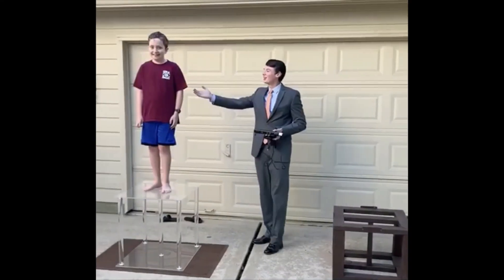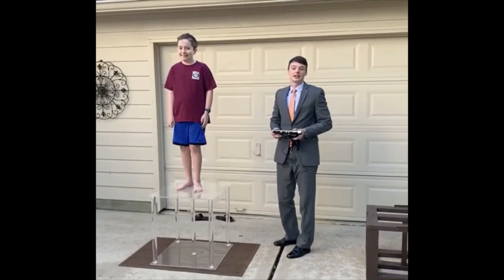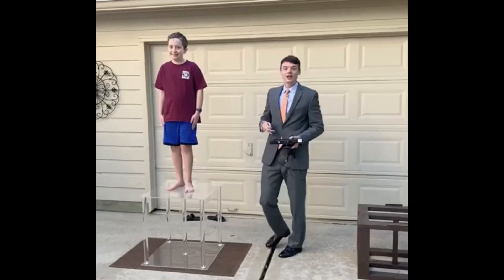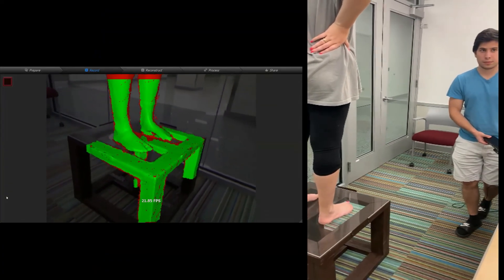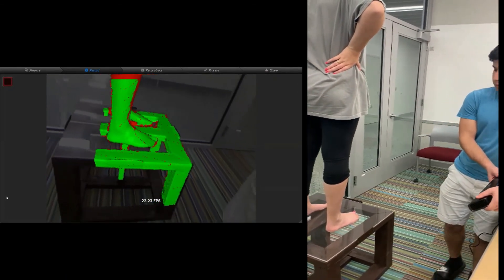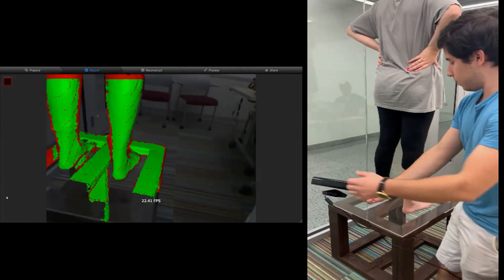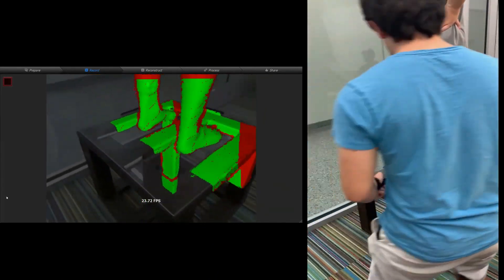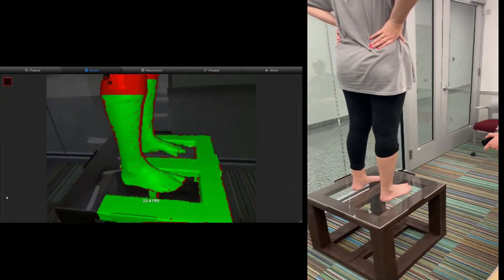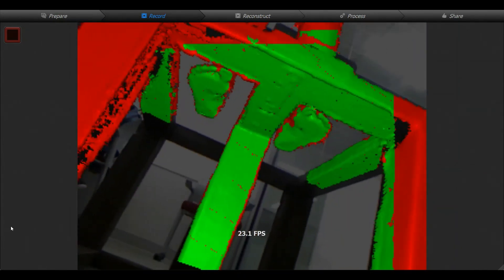Our second design, demonstrated here by my lovely assistant Mr. Jacob, allowed for the ideal scanning height of two feet. The five plexiglass rods, countersunk, allow for ideal strength. The next clip is a side-by-side view of the scanning process, showing the actual scanning process alongside the computer output. This process uses the Kinect sensor of the Xbox 360 Kinect in conjunction with ScanEct Pro software. The bounding box for scanning is set to a cube with sides of 0.4 meters. A typical scan takes between 30 seconds to about 1 minute and 30 seconds. Longer scans produce higher quality meshes but are computationally more expensive. We make sure to get a good scan of the bottom of the foot, as this is essential to producing a high-quality custom orthotic.